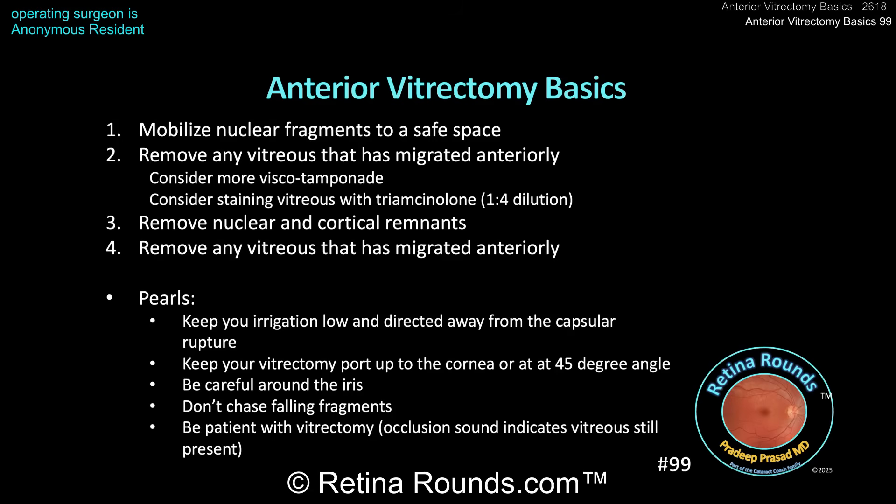Some pearls when performing an anterior vitrectomy. With one hand, you're going to be irrigating — infusing BSS into the anterior chamber. Keep the irrigation level lower so you're not overly deepening the anterior chamber and pushing BSS into the posterior segment, which would hydrate the vitreous and encourage it to come forward. Try to point the irrigation handpiece away from the capsular rupture to decrease the likelihood of hydrating the vitreous or encouraging more vitreous to come forward.